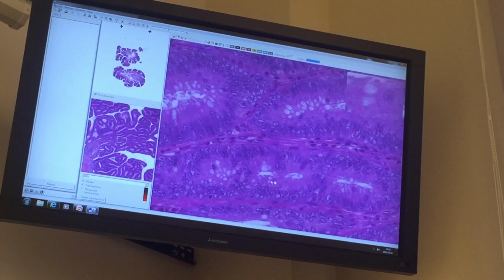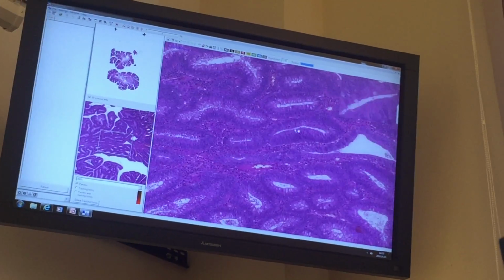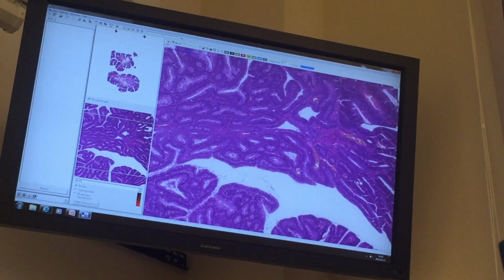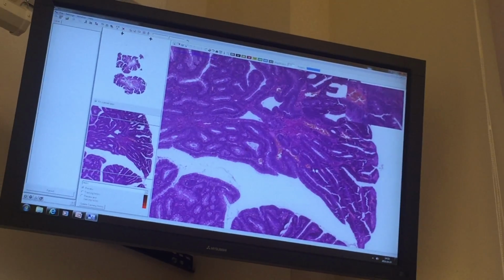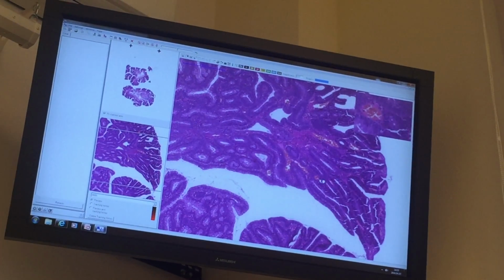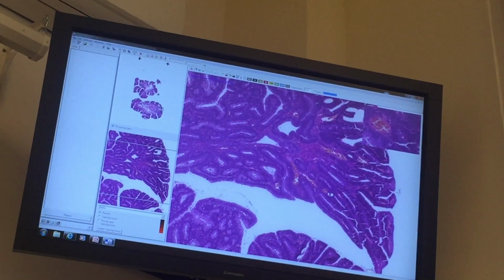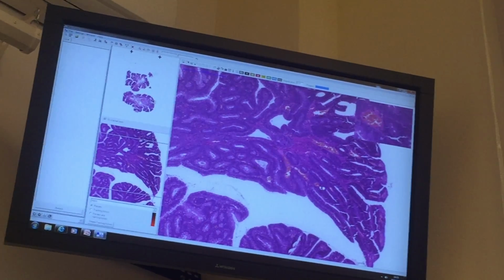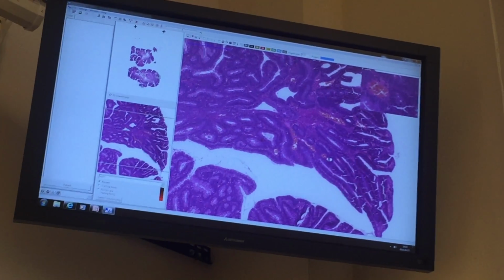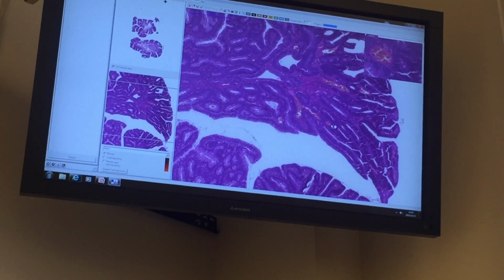Like here you can see a few, like this one. But is it possible that in this one there are none, or like here a few? It's possible that two glands, one high grade, one normal, are right next to each other. Yes, possible, because it's a transformation. This is an extra proliferation of the epithelial glands, and one will be more severe, the other one not. It's like an epithelial tumor, like a tumor of the skin. One cell will be more dysplastic than the other one.